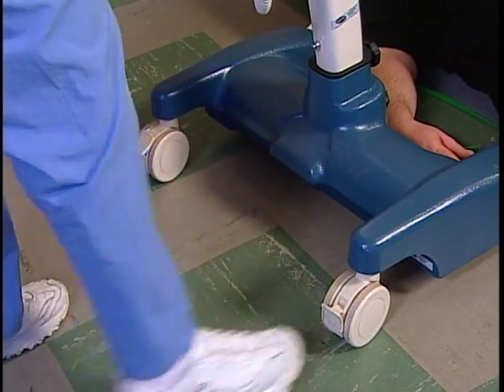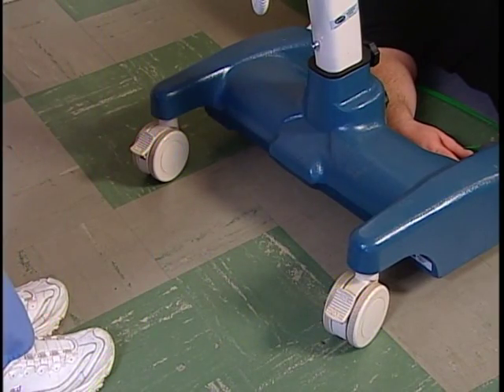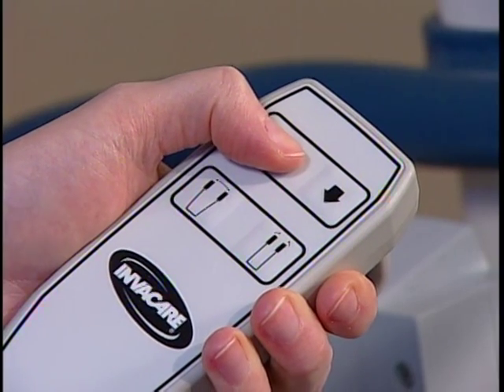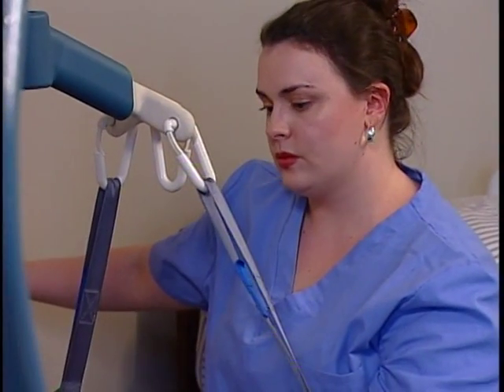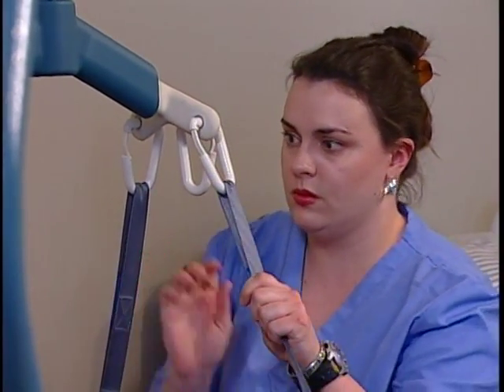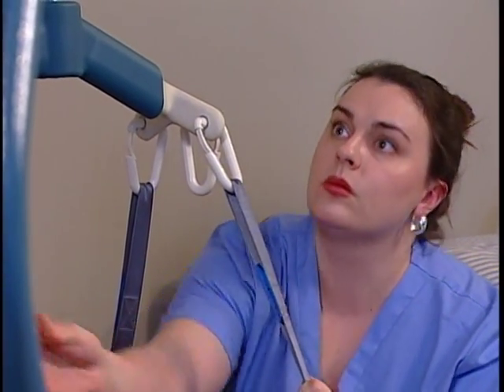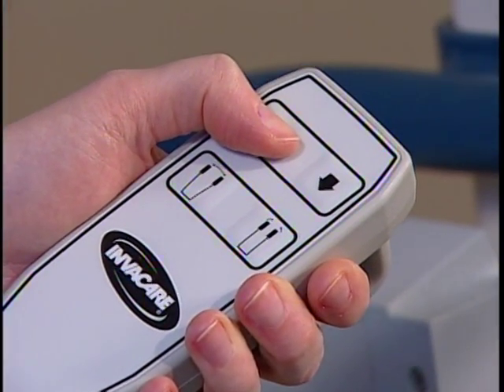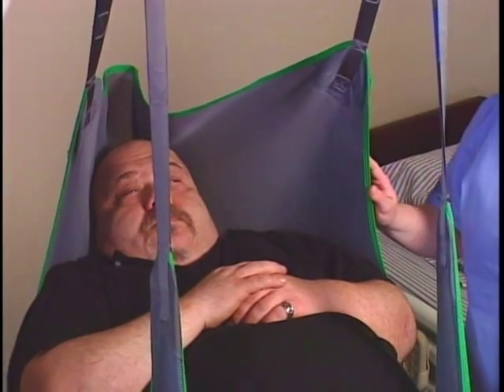Unlock the rear casters. Put a slight amount of tension on the sling by pressing the up button on the hand pendant to elevate the boom. Double check to make sure that all sling straps are secured to the swivel bar. Okay. Raise the resident until they are just above mattress level.